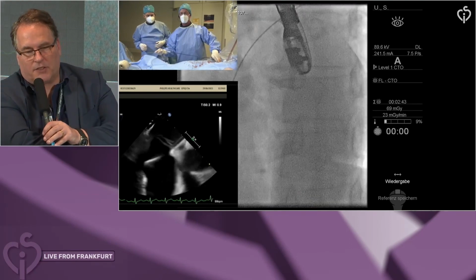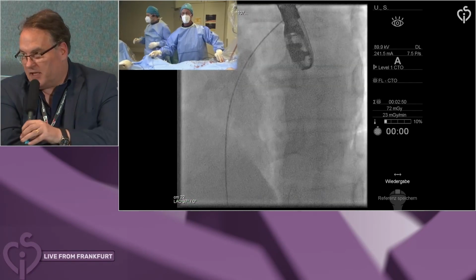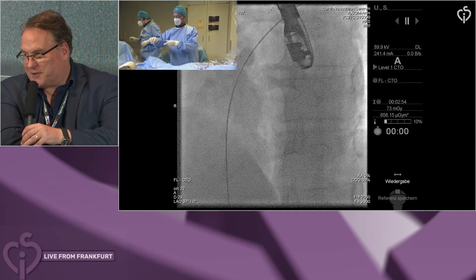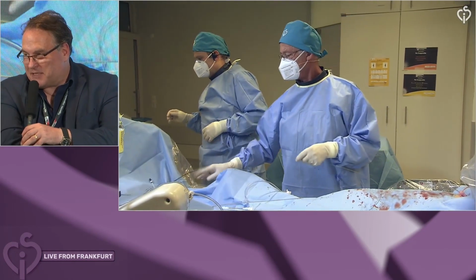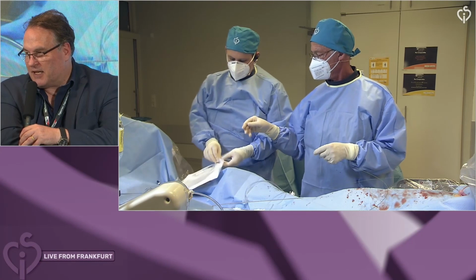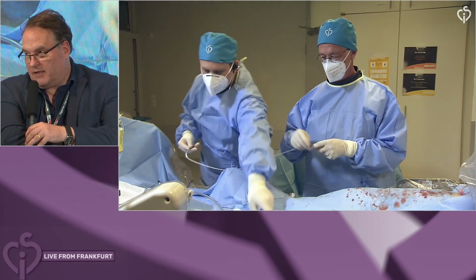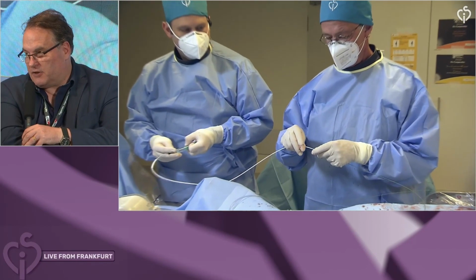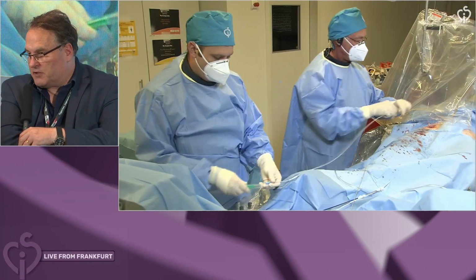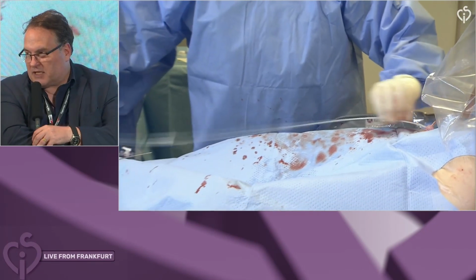Yeah, well, we did in the beginning also, of course, balloon sizing, but I found for the tunnels or for the small sizes, it didn't really change the strategy nor the device. So it's an added part. So if you can do the procedure with 3 minutes fluoro and 10, 15 minutes, and it's a standard device, a standard size, I wouldn't go for a balloon in every case. I only go for balloons in large situations and situations where I don't have a rim and I have a very weak membrane, or in large bore situations like the first case here. I think that it was very valid to go for a balloon, like Horst demonstrated nicely, with those 18 millimeters, and then to decide what ASD device to take. I think in a regular situation, I would skip that, to be honest.